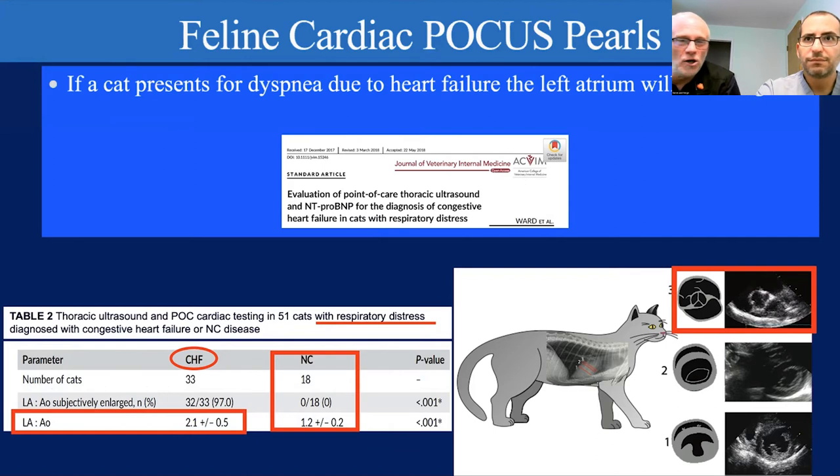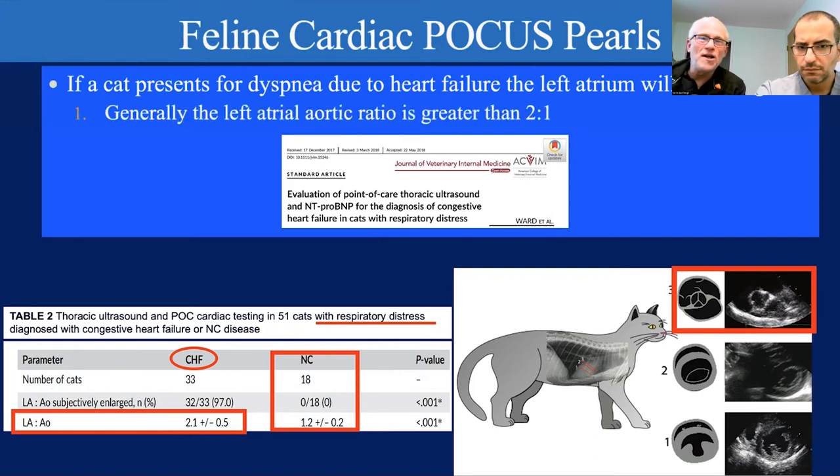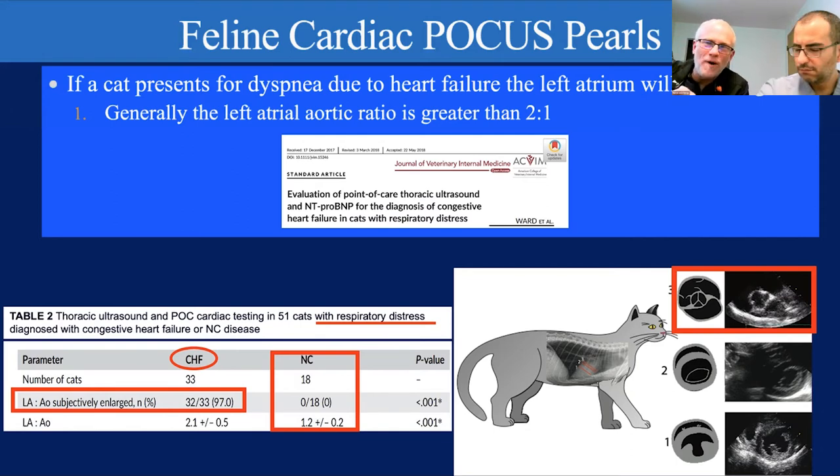All right. And the other thing, Dr. Chalhoub, this is the interesting part that I love. This study also looked at a subjective assessment of the left atrial to aortic enlargement. If we look at that subjective assessment, you can see that 97% of the time, you don't have to measure it. You're not looking for that 1.55:1, or 1.47:1. Subjectively, you can look at that left atrium, compare it to the aorta, and 97% of the time, you can accurately make the call.